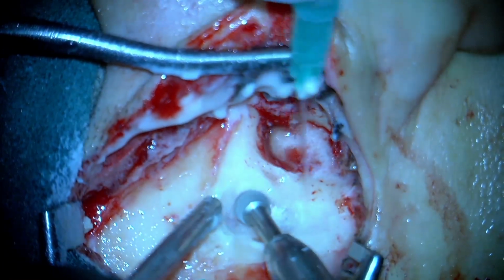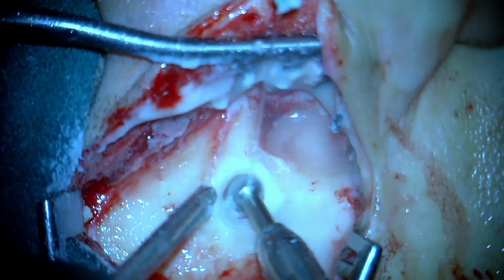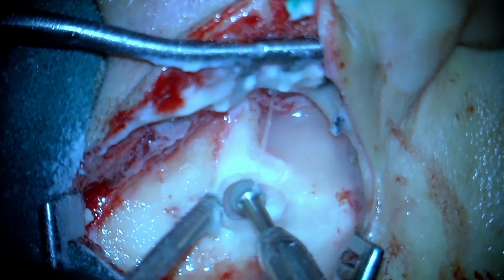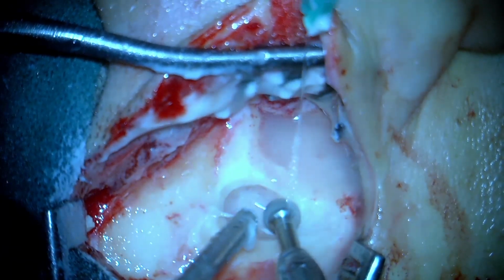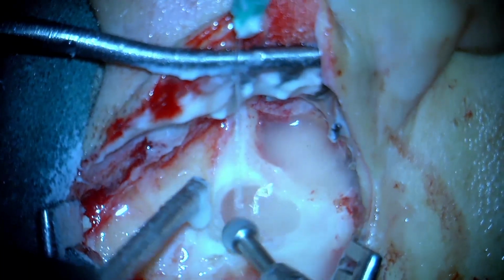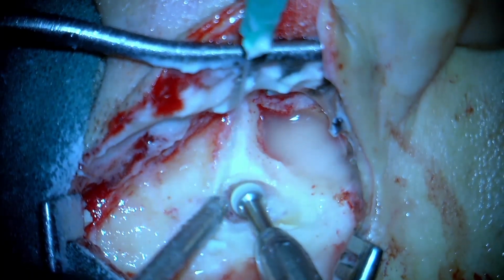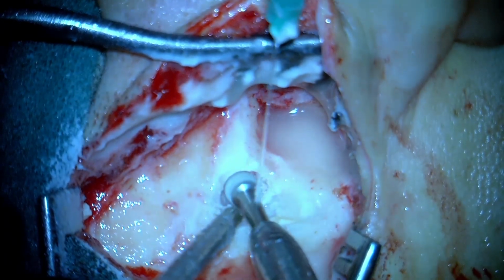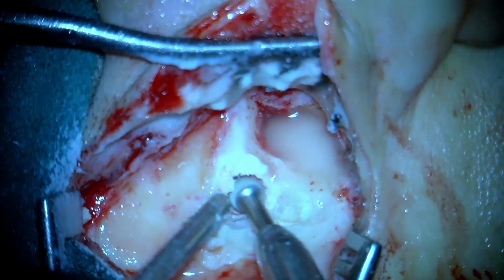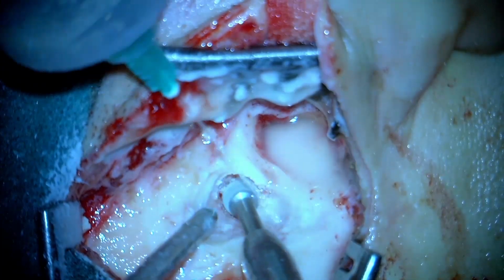But in this patient, it is important to make all attempts to preserve natural anatomy, given that he has minimal hearing loss, and the tympanic membrane is intact, mostly just thickened with a slight retraction posteriorly, but there's no deep retraction pocket or any attic cholesteatoma. So essentially, we are fighting an external auditory canal cholesteatoma that has eroded both the anterior and posterior canal walls. The posterior canal wall has a large defect, which needs to be addressed in this patient.